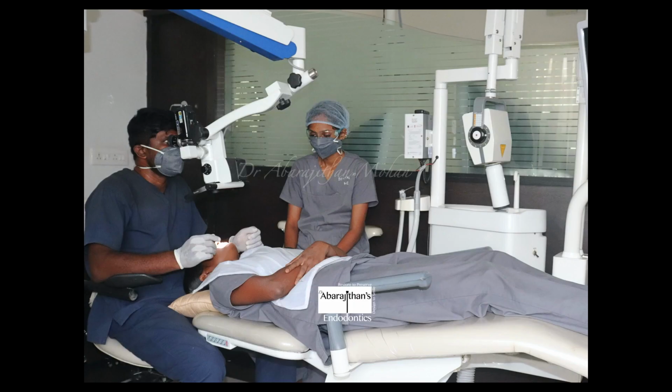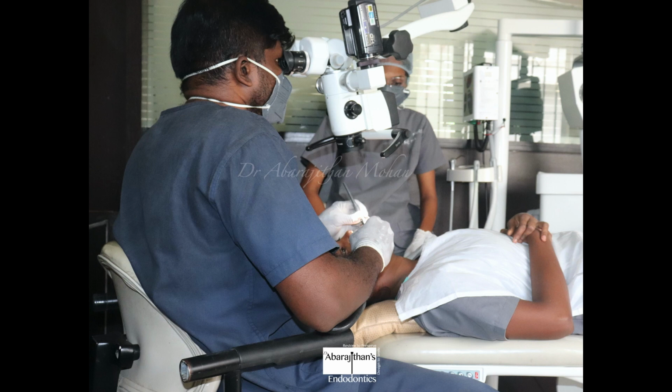So this is the only chair positioning and operator positioning for all the procedures that you are going to do related to dentistry, and especially endodontics. You can see here the operator is comfortably positioned with his knees and his elbows supported and his vision straight, both the back supported and also the neck erect. So I'm going to teach you how to achieve this in this demonstration.